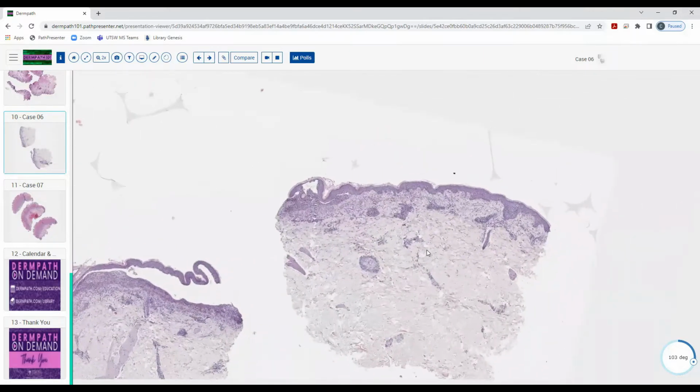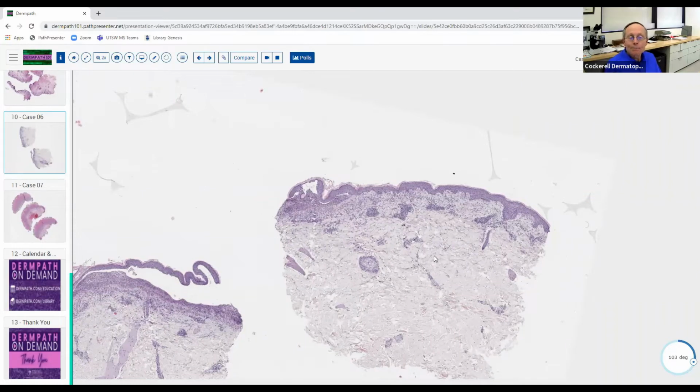All right, this is a punch from, I think, trunk or an extremity or something. Yeah, it's sort of a bland looking area of the body. It doesn't really have a thick cornified layer, and then a lot of hair follicles or sebaceous lobules. So this is the most common place we like to take biopsies from an inflammatory skin disease. And we avoid the face, we avoid the palms and soles if we can. So what's the general pattern we're looking at here?